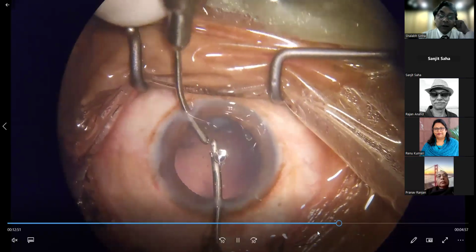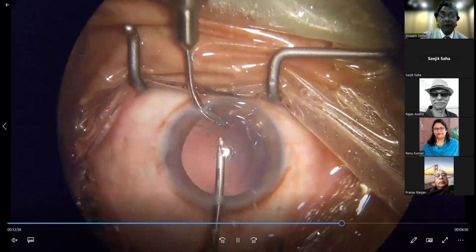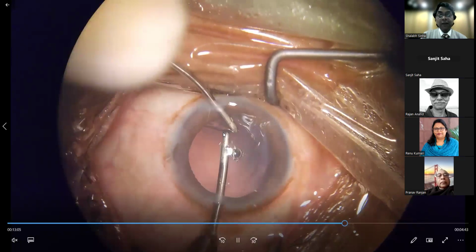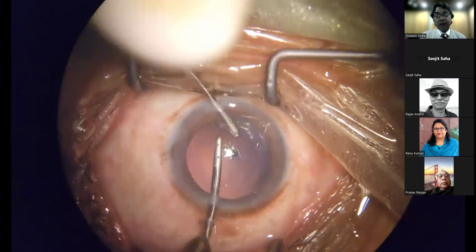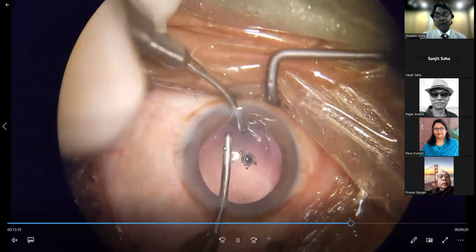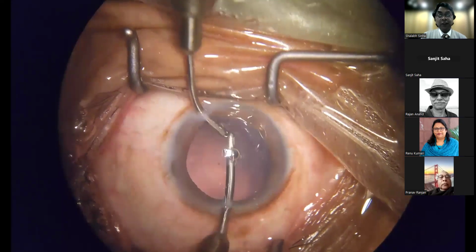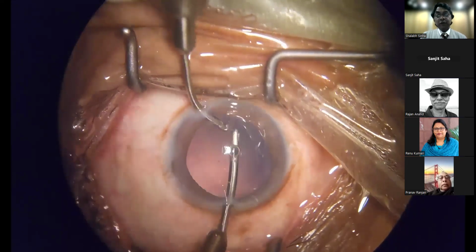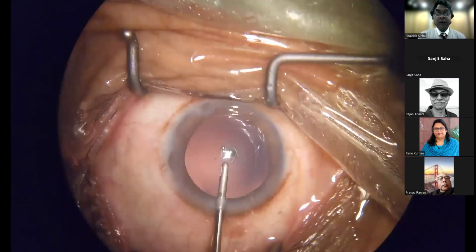So whatever cortical material is left behind can also be removed without having to change your hands. So see where the irrigation is. The irrigation also plays a role, not just in giving fluid inside, but how you place the irrigating cannula also helps in removing the cortex and protecting the posterior capsule. Most often, I'm able to remove most of the fibers. Some fibers remain, doesn't matter.